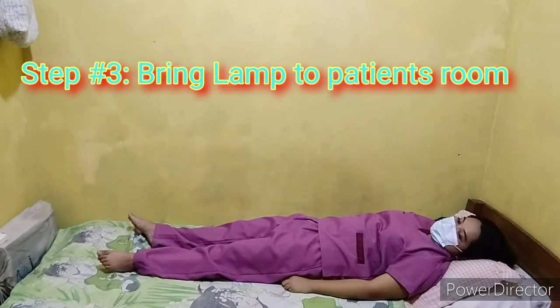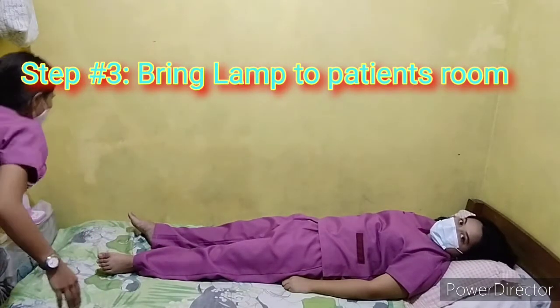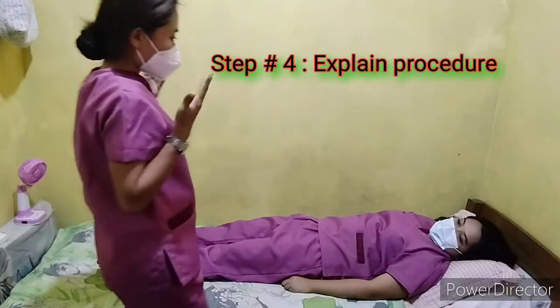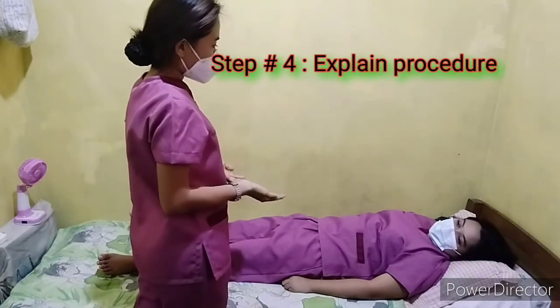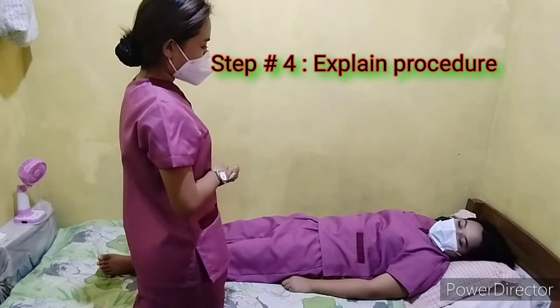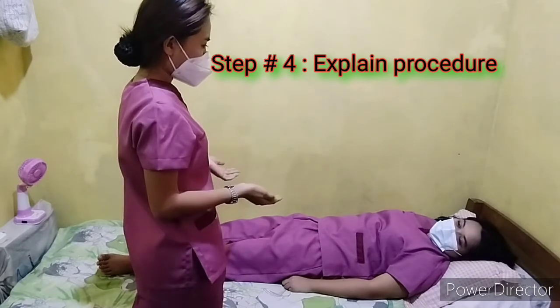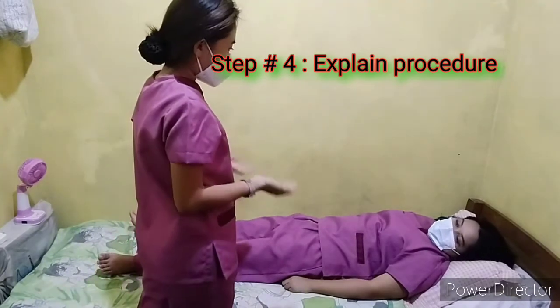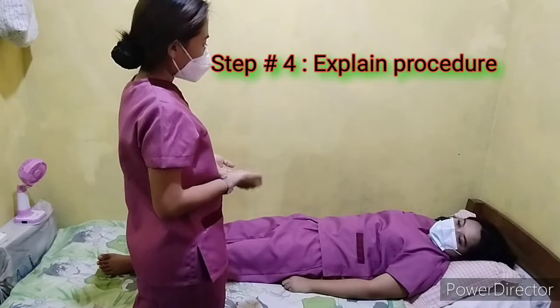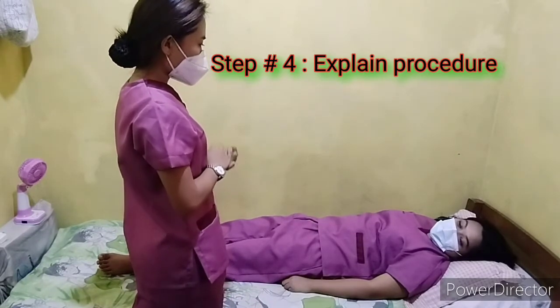Bring the lamp to the patient's room. Bringing equipment needed to the area of treatment saves time and energy. And next, explain the procedure to the patient. Hello ma'am, my name is Rachel Mahinay, and this procedure is all about heat lamp treatment or Peri-Light. This procedure will promote drying and healing of a perineal wound, stimulate circulation, prevent infection, and promote comfort and relaxation, ma'am.